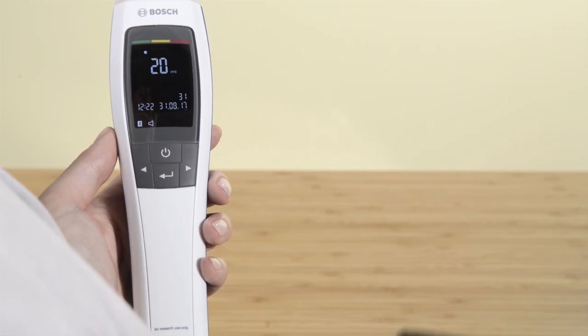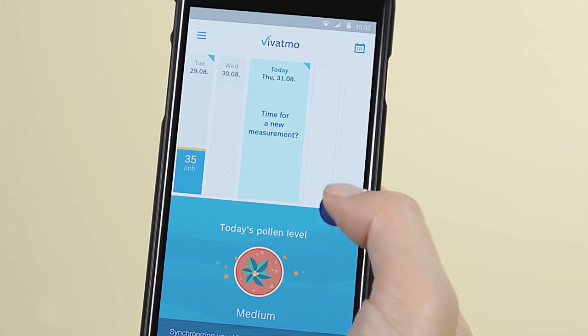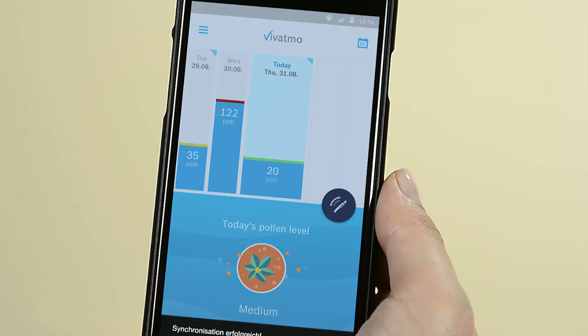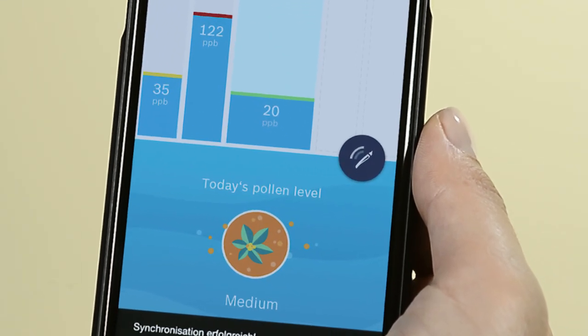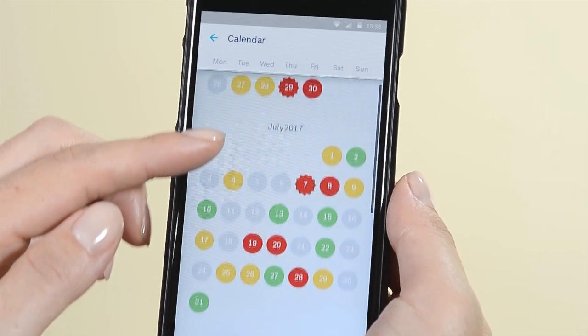The ideal supplement to your Vivatmo.me is the corresponding app. The practical diary function documents your asthma behavior quickly and effortlessly via Bluetooth. In addition, it informs you about the current pollen count, for example. With the calendar overview, you always have the course of your FeNO values at hand. And, together with your doctor, it's even easier to get your asthma under control.